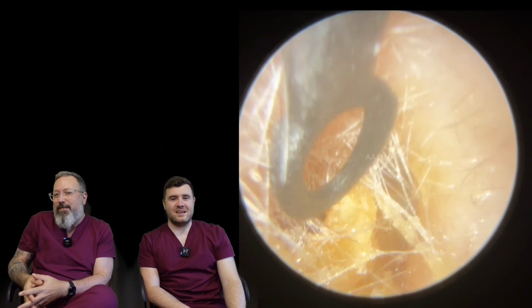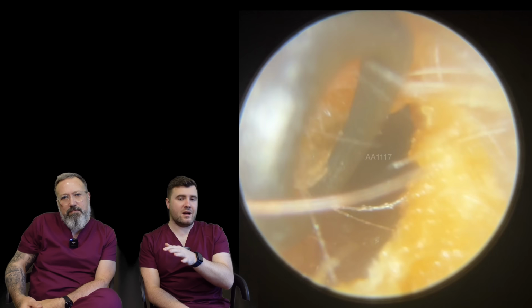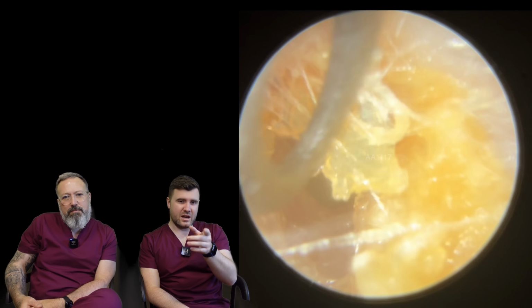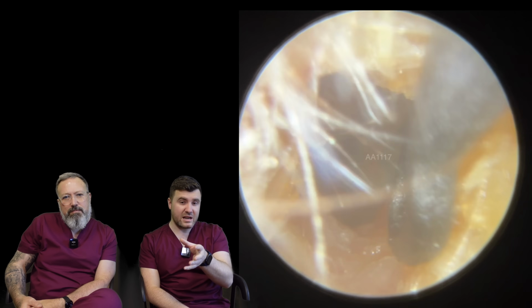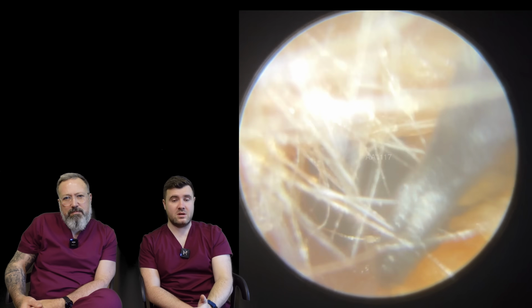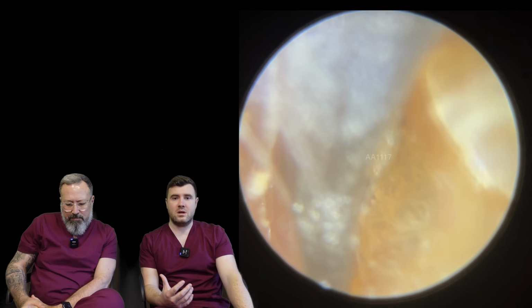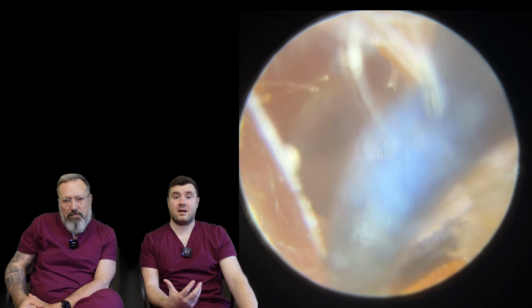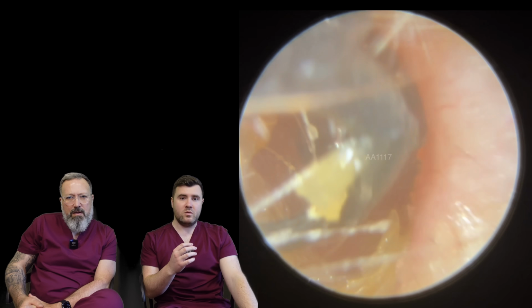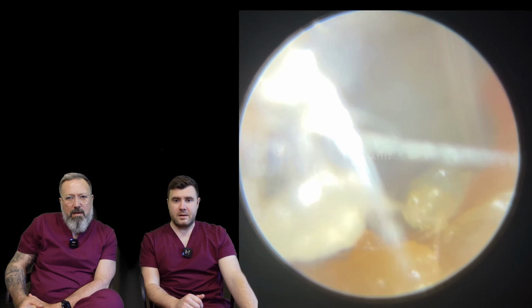So yeah, this is, you can see it. It looked really soft to start with, and I thought, I'll try the suction first just to see how it's moving. You can see it's not really fully blocked. It was just a sheet basically covering up the ear canal. You'd be surprised how much of a difference that can cause a patient, especially if there's a hearing loss already there. So we've managed to shear away some of this dry skin here.